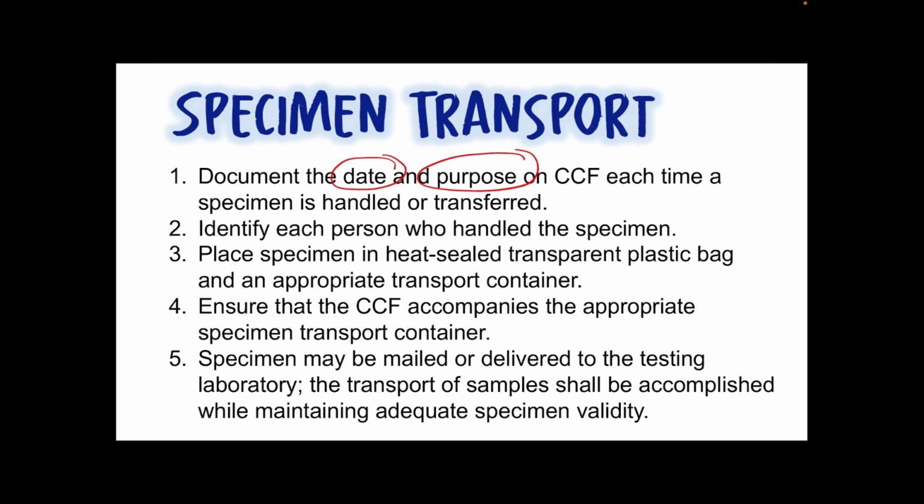And when courier services are utilized, for example, the time of receipt from the time the specimen is collected at the collection site and the time of the delivery to the laboratory must be documented on the CCF. So from the time the specimen is received at the collection site up to when it is delivered to the laboratory, all of that again must be documented on the CCF. Next one, place the specimen in a heat-sealed transparent plastic bag and an appropriate transport container.